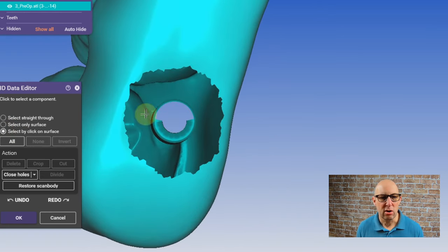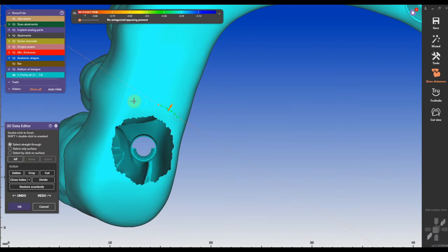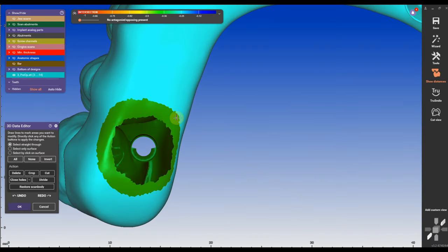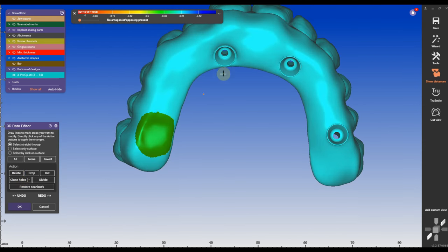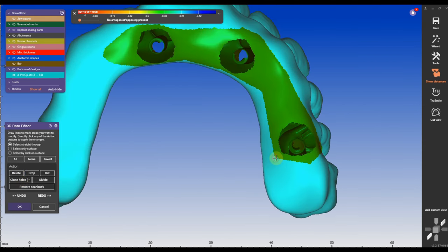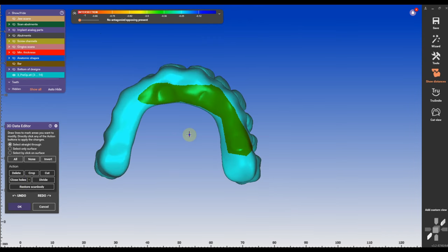I'm going to do all of this for all the other sides. I'm going to close all the holes, I'm going to delete all the floaters and that's what I'm going to do to the pre-op scan which I need later.